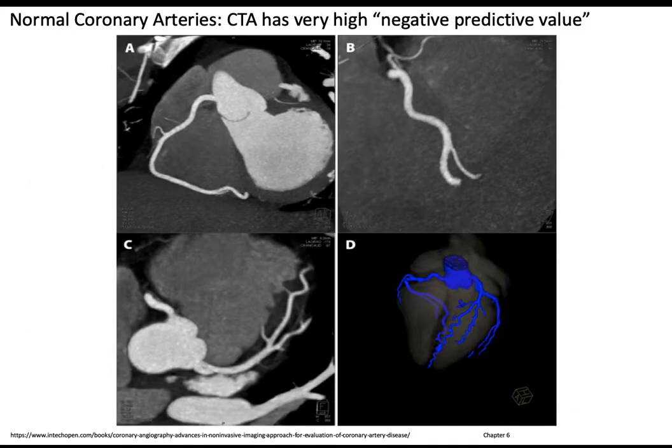Okay, so using that definition, you should be able to put into words what it means for a cardiac angiogram to have a high negative predictive value. What does that mean in words? You go into the doc tomorrow, you get a CT angiogram, and they tell you some result. If I tell you that the study has a high negative predictive value, what is the result that you can feel confident in? Does that mean that if they say you're clear, you don't have a problem, that there's a really good chance you don't have a problem?